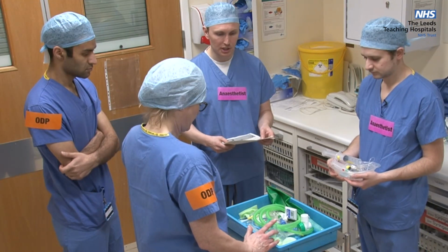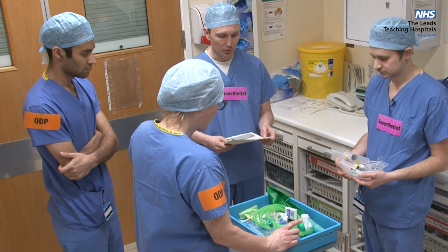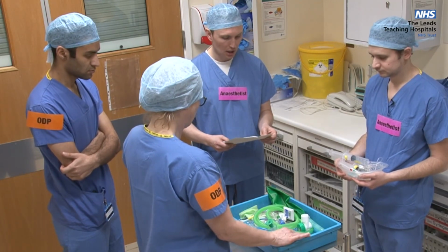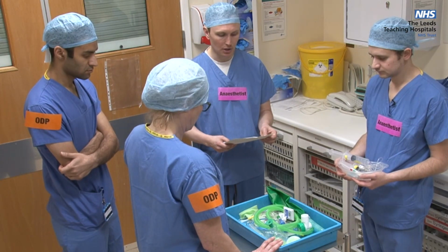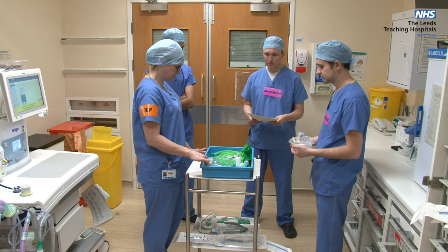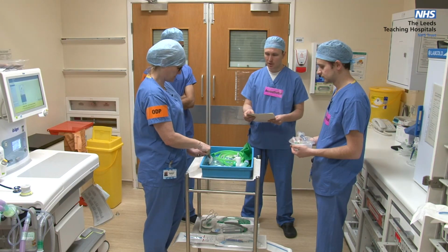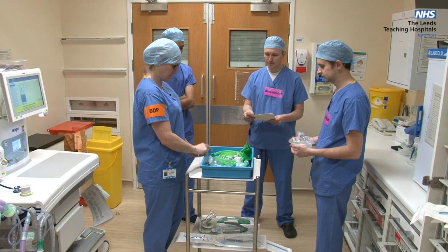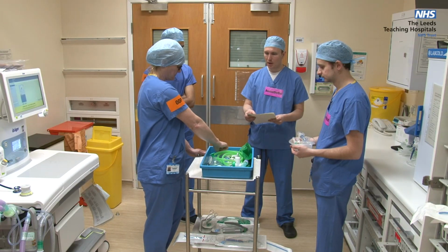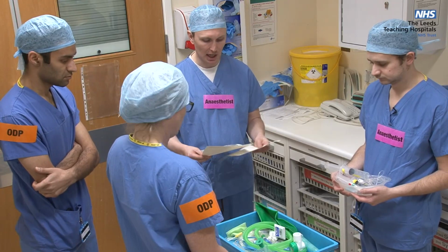Subglottic suction endotracheal tube size 8 we have chosen. Yep. Mapleson C circuit. Yep. HME filter. Yep. End-tidal CO2 line. Yep. Bougie. Yep. Tube tie. Yep. Optilube sachet. Yep. 20 ml syringe. Yep. Closed suction catheter. Yep. Tube clamping forceps. Yep. Fine bore feeding NG tube. Yep. And an intubation checklist that's in my hand.